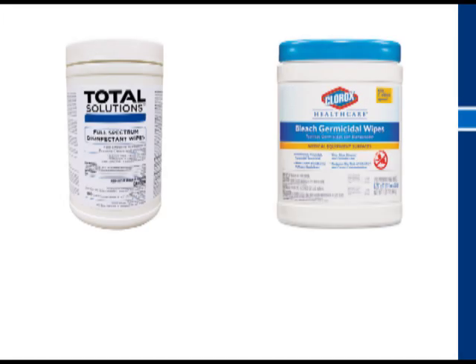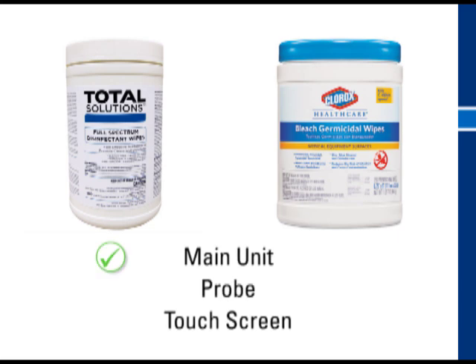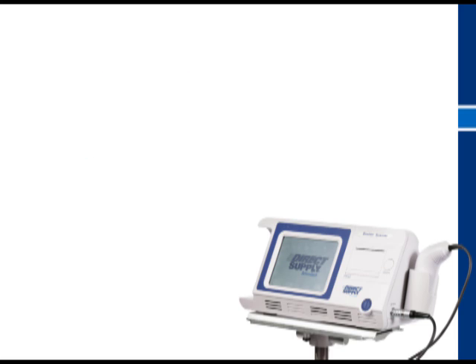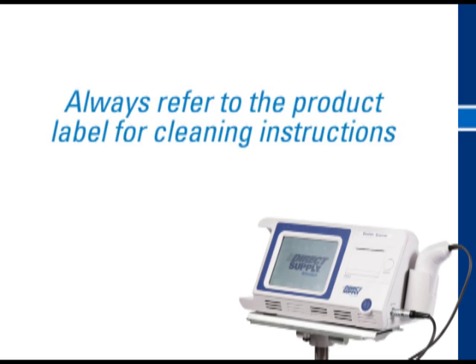The Full Spectrum wipes can be used to clean the entire unit, including the touch screen. The Clorox germicidal wipes may only be used on the unit, not the touch screen. The touch screen may also be cleaned with a soft cloth, such as a soft paper towel or cotton pad with a mild detergent and water. Always refer to the product label for cleaning instructions and details about the specific organisms and viruses the product is designed to be effective against.